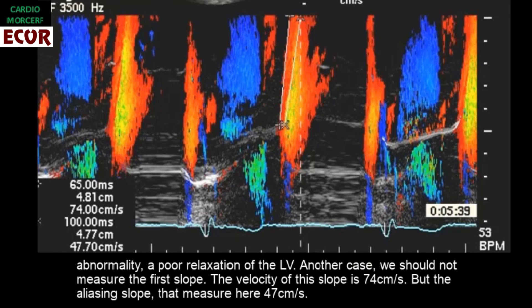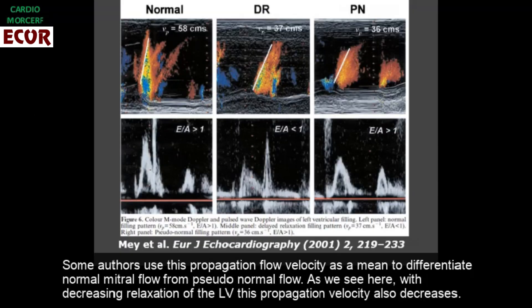In another case, we should not measure the first slope. The velocity of this slope is 74 cm per second, but the aliasing slope measured here is 47 cm per second. Some authors use this propagation flow velocity as a means to differentiate normal mitral flow from pseudonormal.